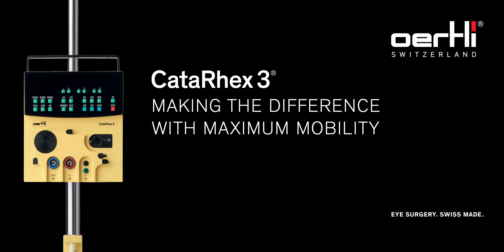Welcome to our CataRhex 3 training video. With this video we will teach you how to complete a basic setup for cataract surgery using the CataRhex 3.